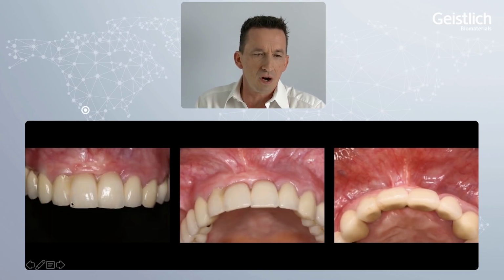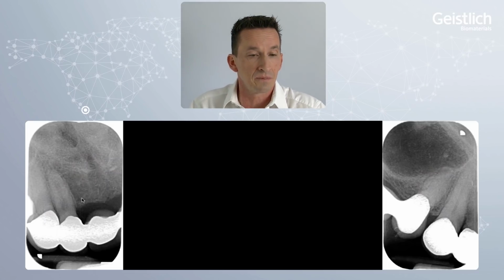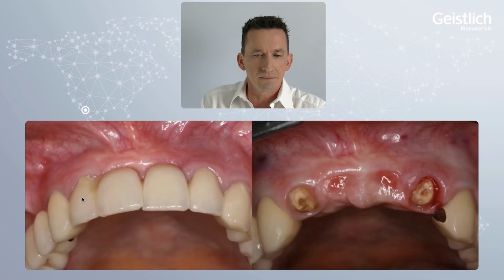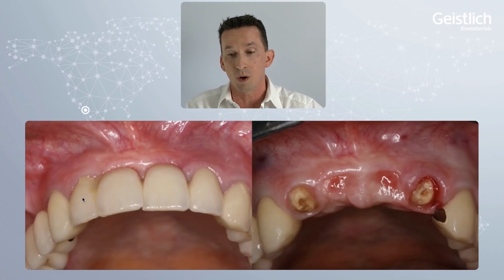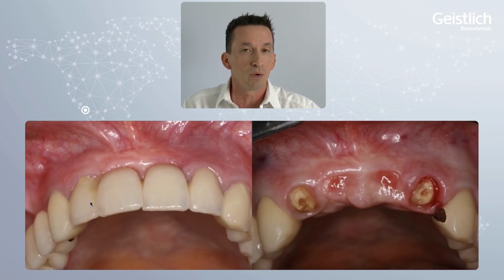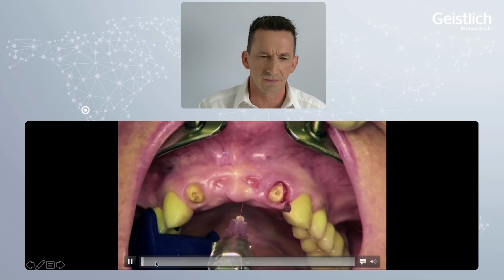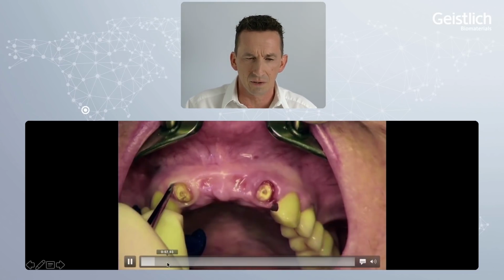You see, this is her upper bridge, which was fixed to the neighboring teeth with composite. When she came in, she told me, "Doctor, please do only one shot." That's the X-ray, and that's when we took off the bridge. You see both roots were broken beyond the gingiva, almost at bony level. Now you see the surgical approach. We took out both roots.